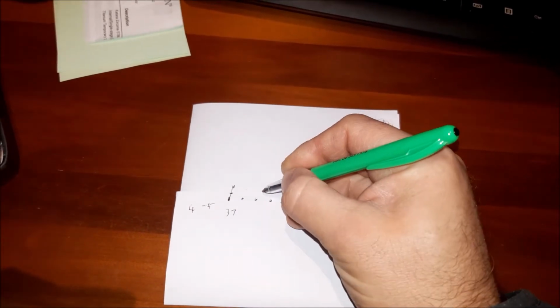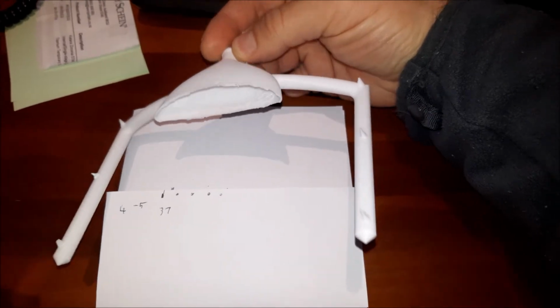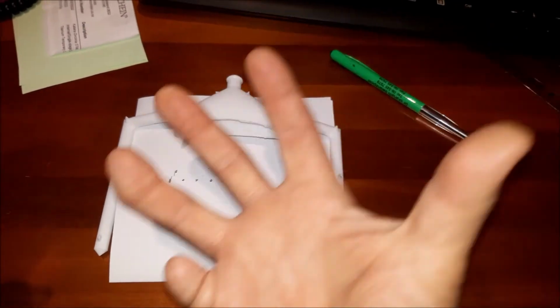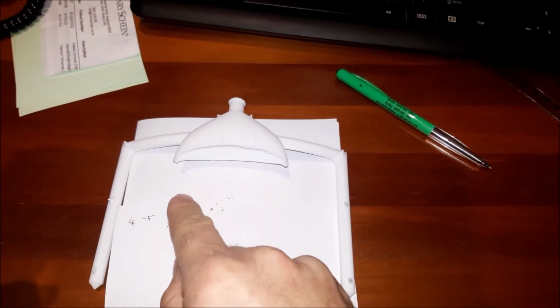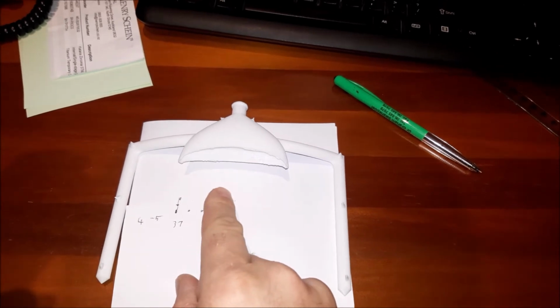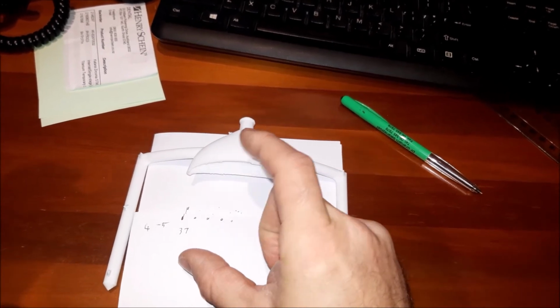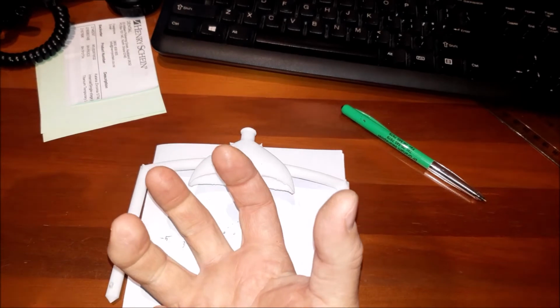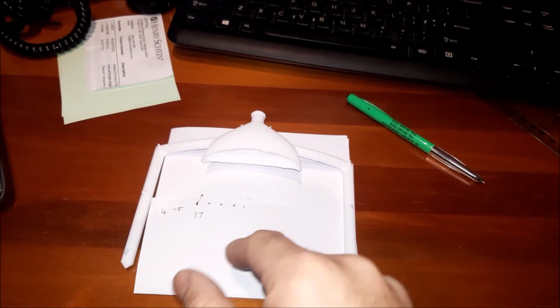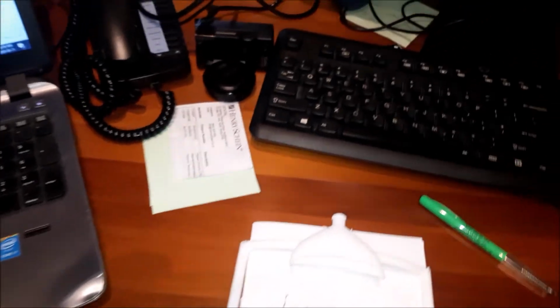and for the rest of the teeth you have to take it forward along the arch like that. So it's beneficial for this thing to work if you have a nice and deep bowl there. So it's beneficial for you to go as far back as possible, anchor there with a clamp, and then work on, say, the 3-4, even the 3-3, as far distal as you can, and then isolate the whole arch, because that bowl will act as a weir, and the turbulence created in there will hopefully cause an area of lower pressure so that it disappears into the chalice.